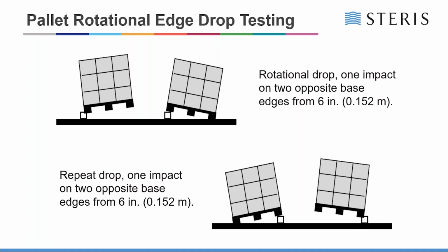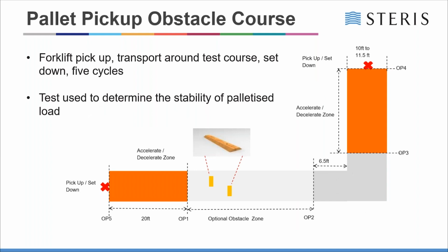And what is acceptable? Can you allow for, say, some slight overhang, or is that not allowed? To me, that would be an absolute no-no, for a very simple reason: once the product moves off the side of the pallet, you've lost the compressibility of it, because you're no longer transferring the load down from the top of the pallet down through the boxes onto the pallet. You're now going into open air on the edge of the box. So typically what's done in this test is the product is raised up to 6 inches and supported, raised higher on the opposite side, and then dropped, and see what typically happens.